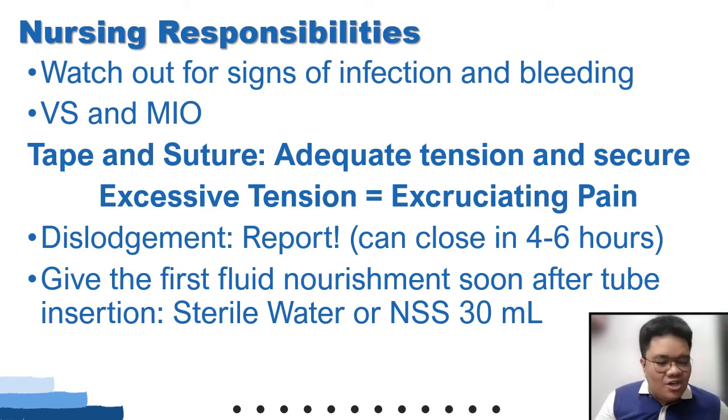Now, sir, earlier you mentioned that if the patient excessively moves, there's a possibility of dislodgement. If the tube, my dear students, would be detached, you need to report it right away. Okay?